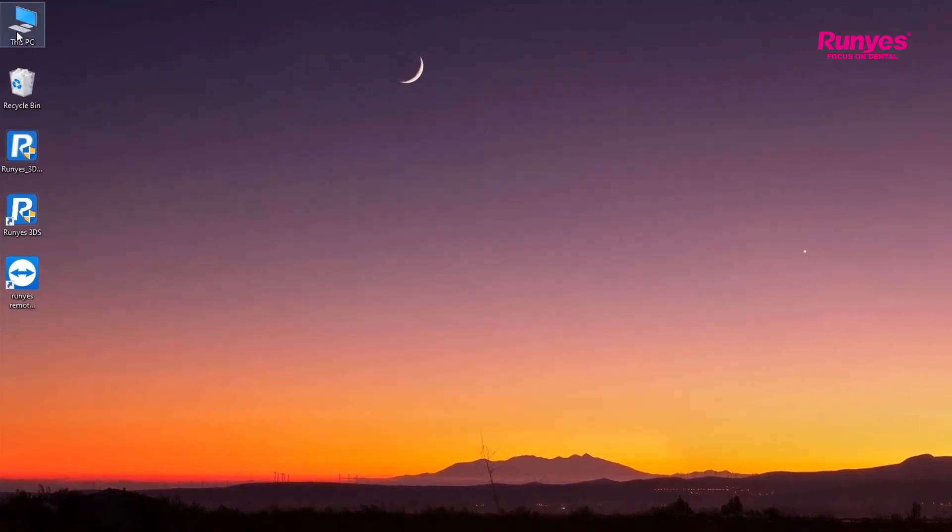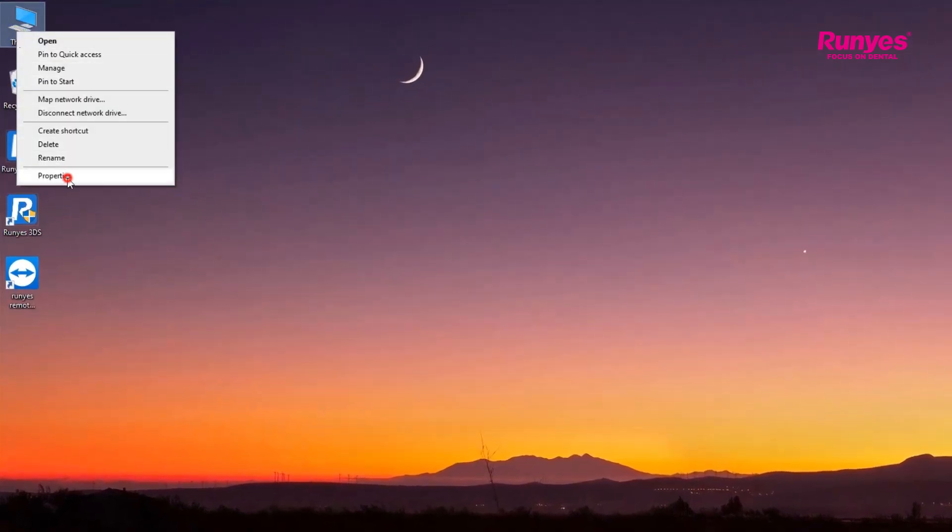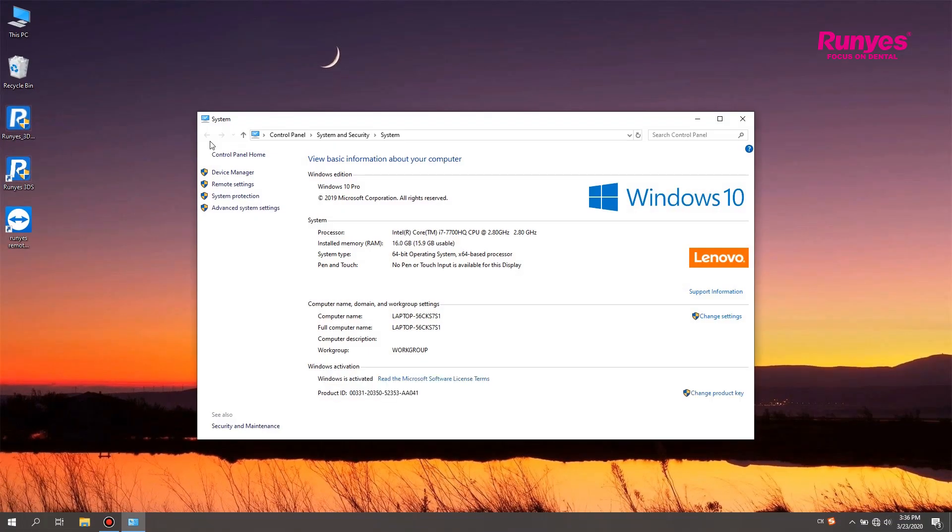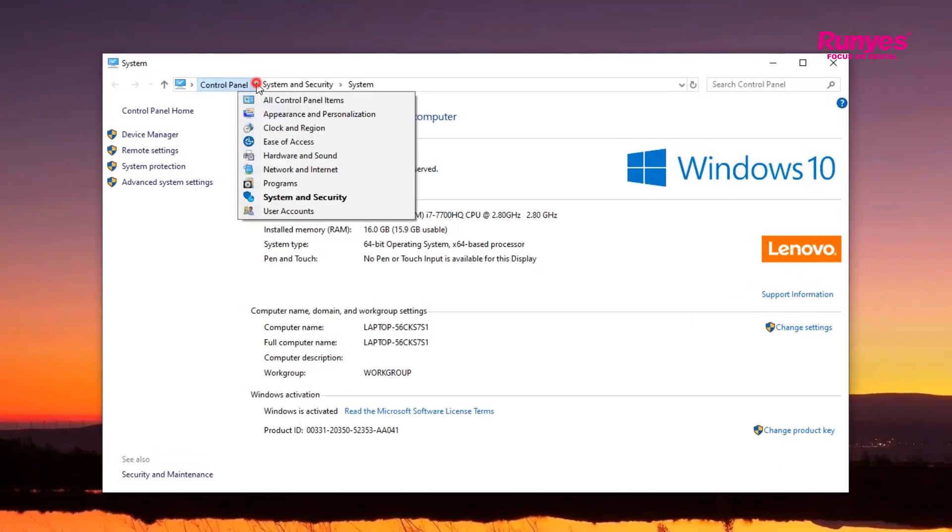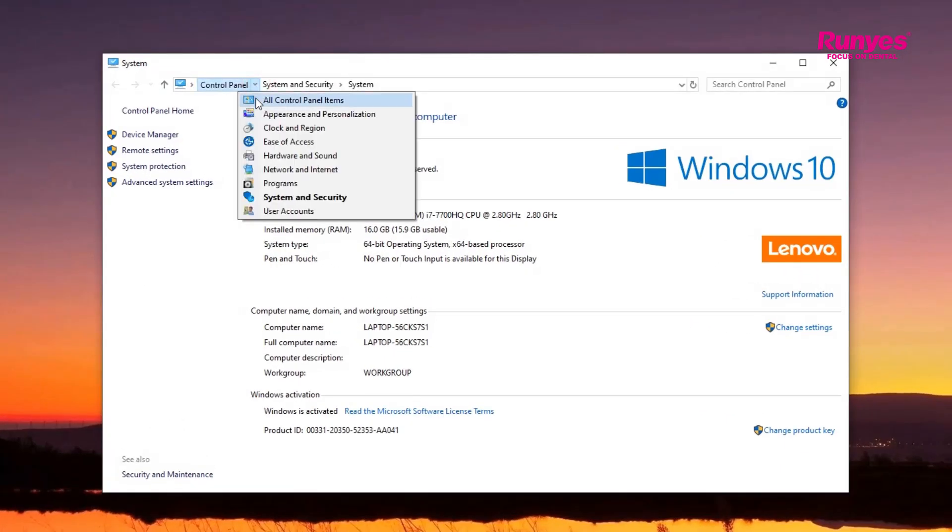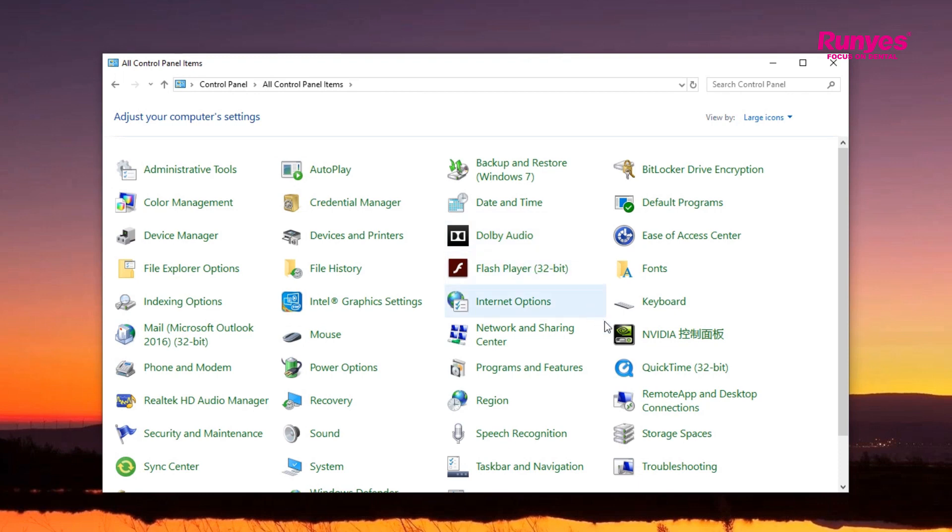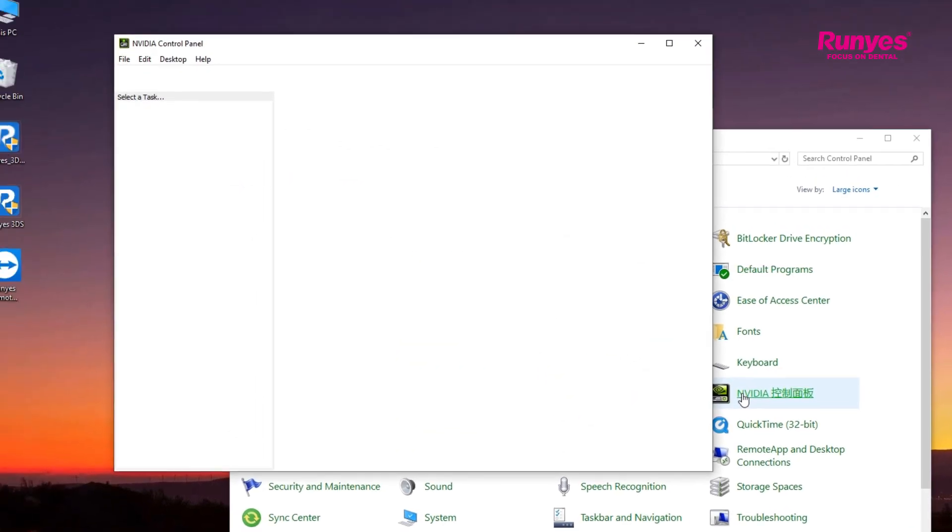Or you can right-click the PC icon and select Properties to enter the next menu. Click all control panel items on the control panel. Select the NVIDIA control panel to set up the graphic cards.